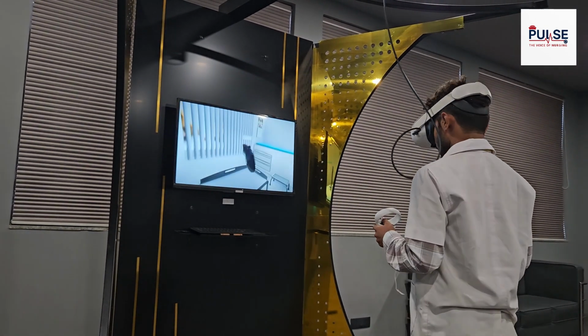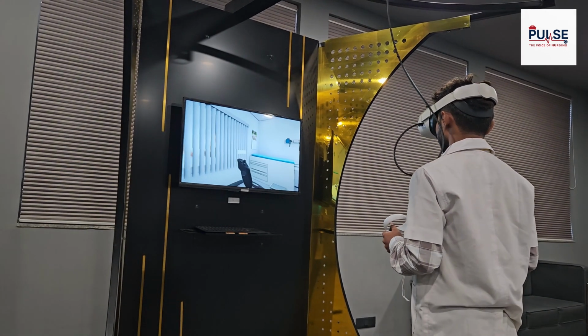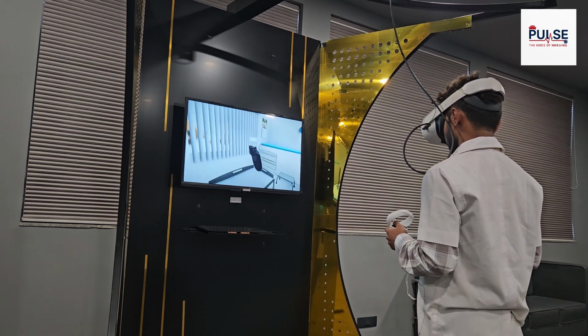So the task has been completed, and I can see that you may require eyeglasses. Anyway, it shows you a refractive task to complete.